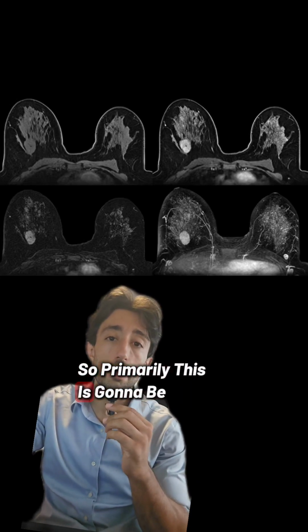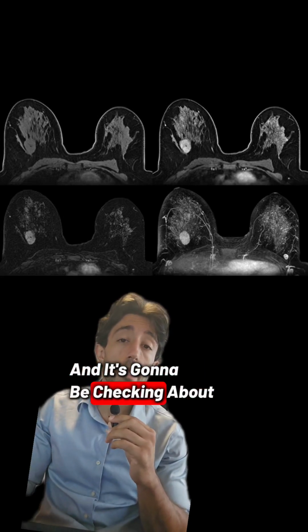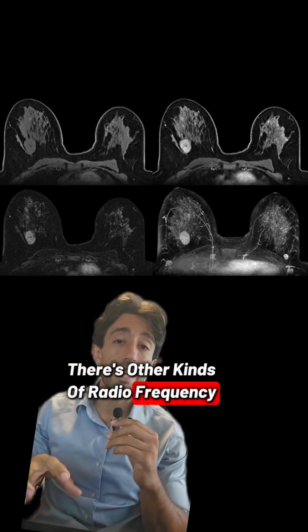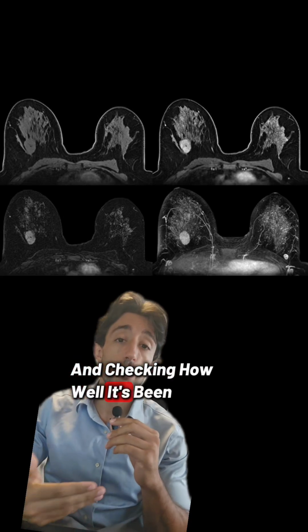Here we have a breast scan using an MRI machine. So primarily this is going to be looking at any growth that may have occurred, usually due to cancer, and it's going to be checking the progress after any kind of treatments that may have happened, whether it's surgery or other kinds of radio frequency, anything that may have been trying to get rid of the cancer, and checking how well it's been responding.